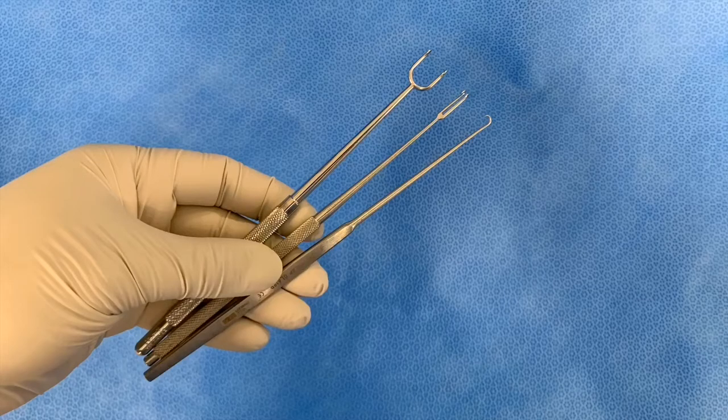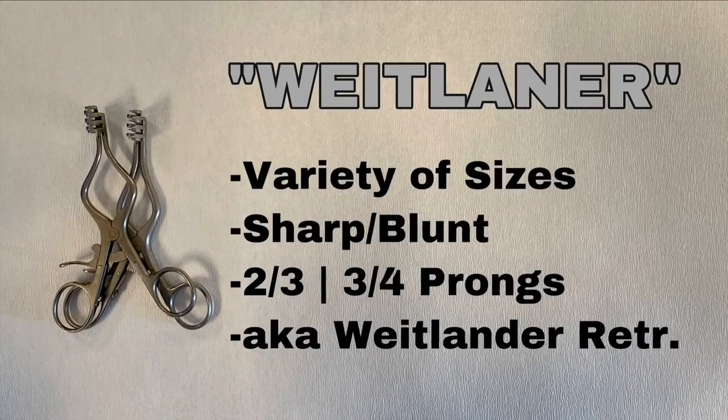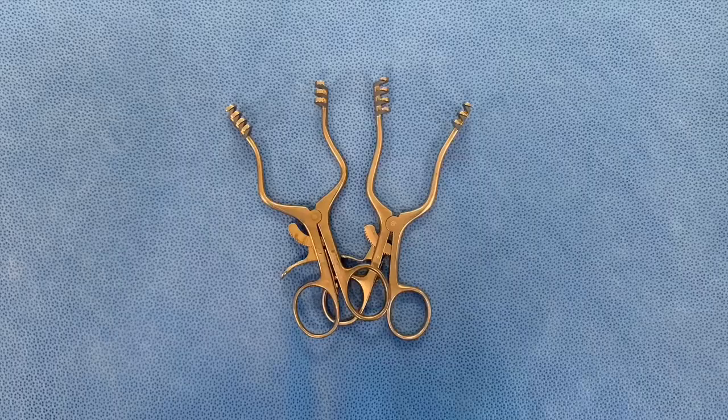The skin hook is very delicate and very sharp, so make sure to always use your protector when handling it. This is the Weitlaner retractor. It comes in a variety of sizes, can be sharp or blunt, and can be two-and-three prongs or three-and-four prongs. It is also known as the Weitlander.